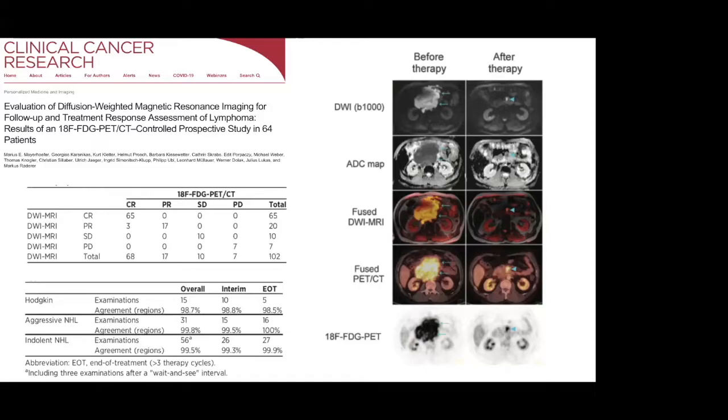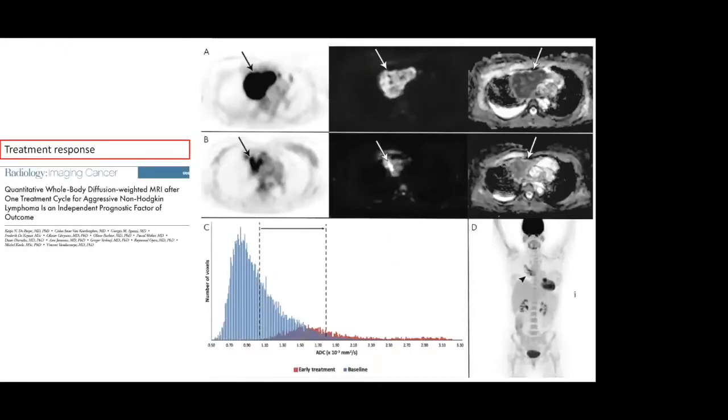Especially for aggressive non-Hodgkin lymphoma, an important addition to the treatment was the addition of immunotherapy. And that, of course, creates an influx of inflammatory cells. For PET-CT, it can be a bit tricky for the interim PET to call false positives. So that was kind of the idea of why to perform this study.